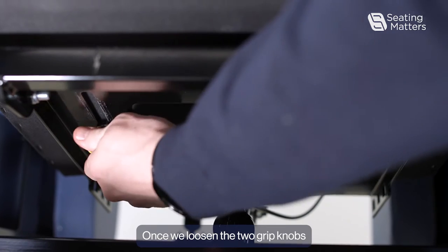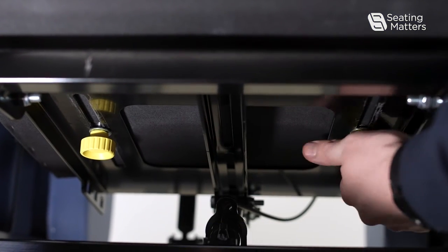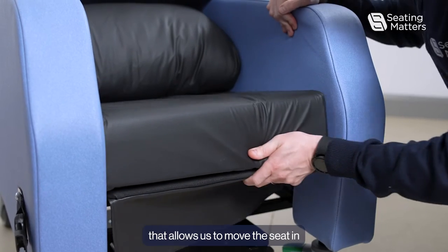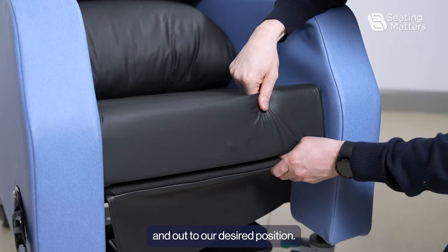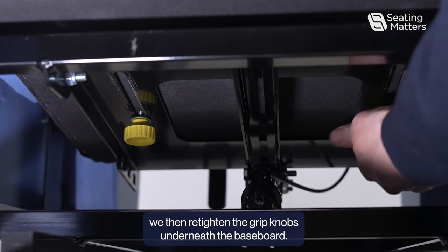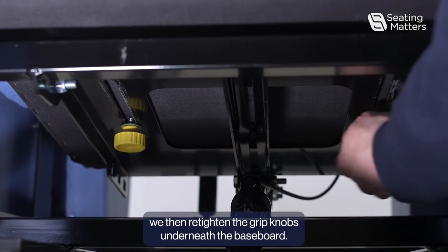Once we loosen the two grip knobs, that allows us to move the seat in and out to our desired position. Once we have the seat depth we require, we then re-tighten the grip knobs underneath the baseboard.